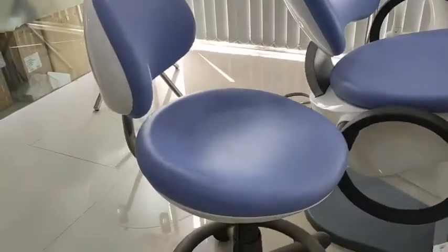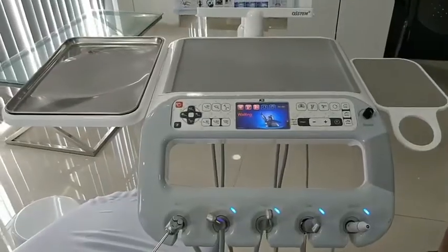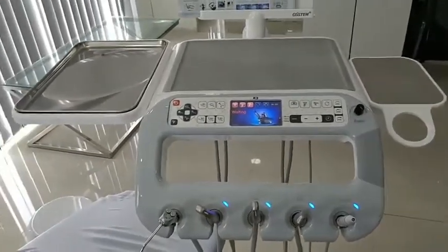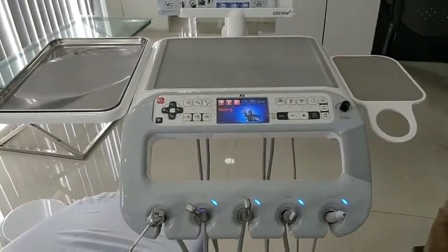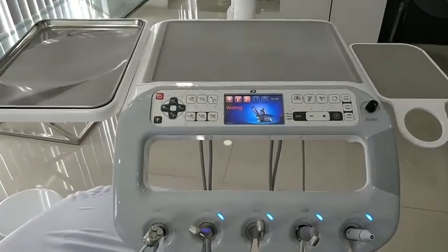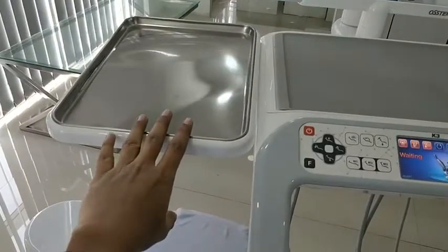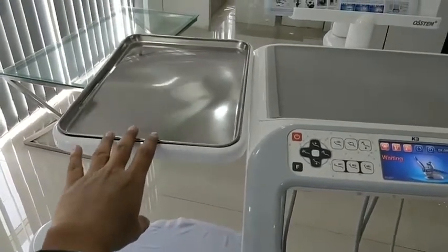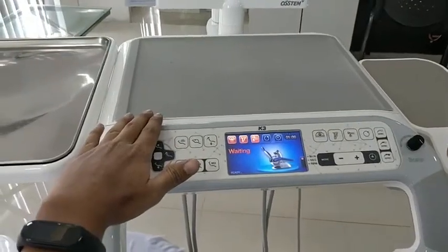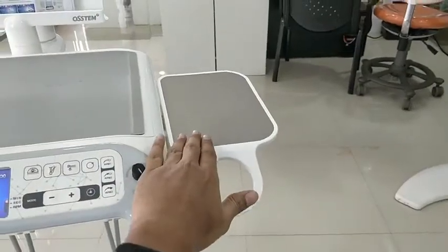Let's start with the doctor's table. As you can see, Osstem provides a wide doctor's table for surgery. When a doctor needs to do a surgery, they can keep larger surgical instruments on this table, as well as smaller instruments.